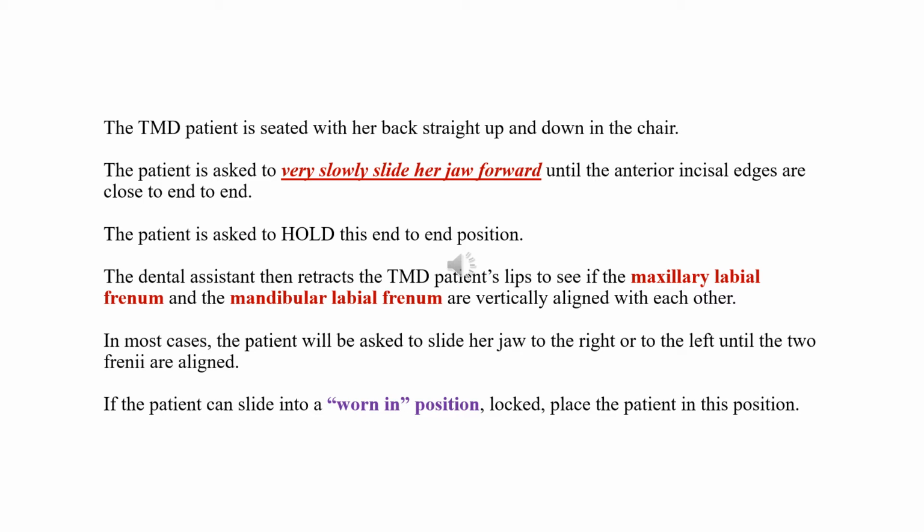We only know one bite position. That is the therapeutic bite position. When the person moves their jaw left, right, we don't know what that is. We are not recording that. So we don't know what it is. But we do know that the upper and lower jaw fit together exactly into the therapeutic bite position because we had the patient actually bite into the wax at that real position.